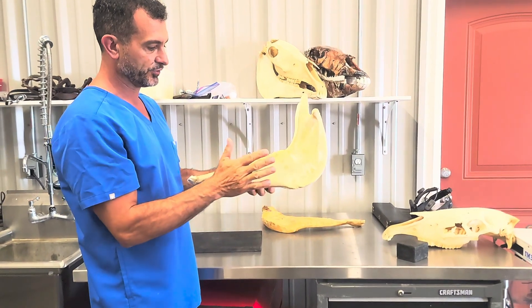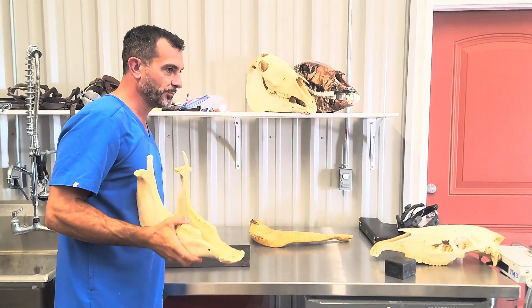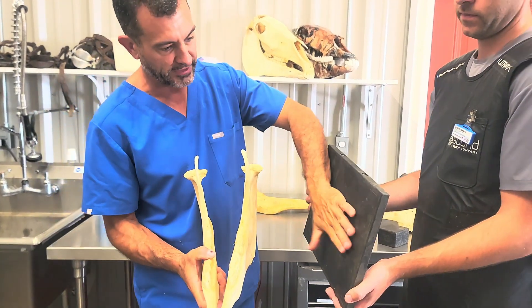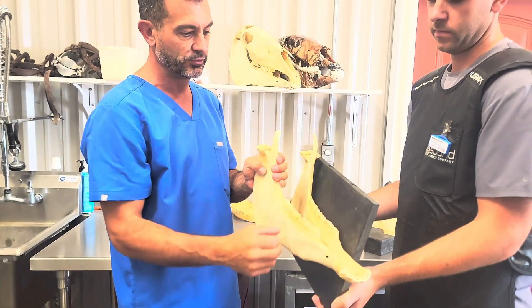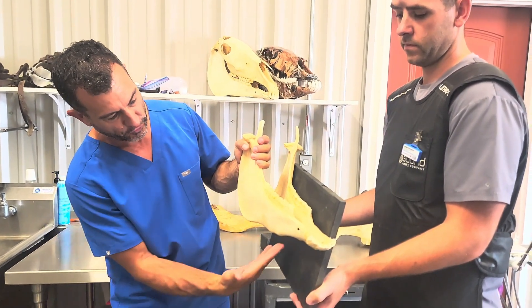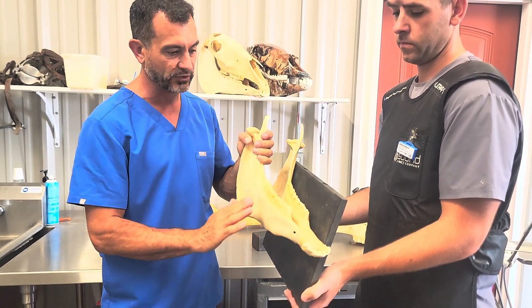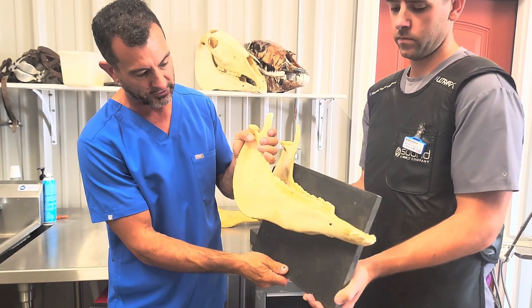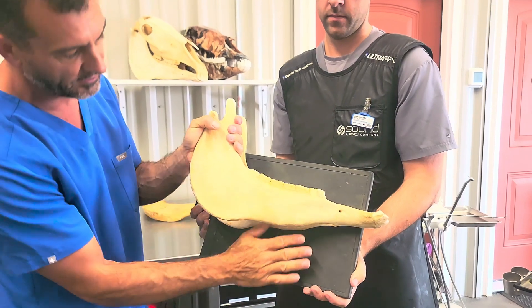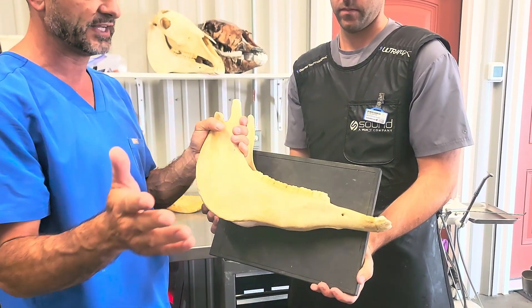There are three views we use. Let's say we're trying to image the horse's left side — the number three quadrant. The first view is to simply put the plate right up close to the horse's mouth, always with a block in the mouth, and then shoot in a ventral-to-dorsal fashion. Depending on the age of the horse you may need to go steeper, but this is going to shift the quadrant up so you won't see those teeth very well, but the apical region of the teeth will be cast down on the plate and you'll get a good image.